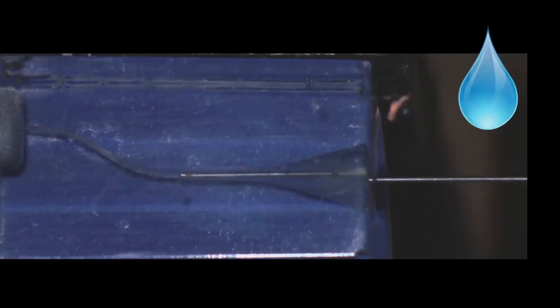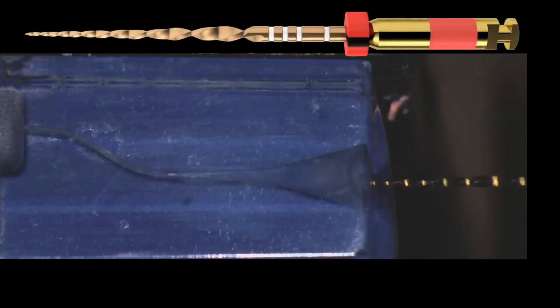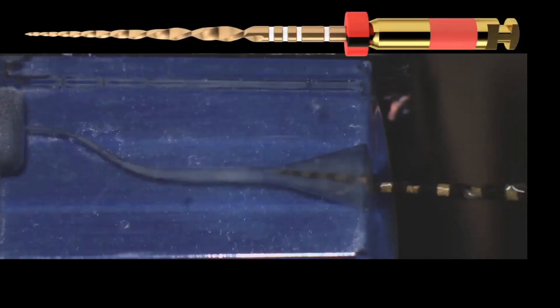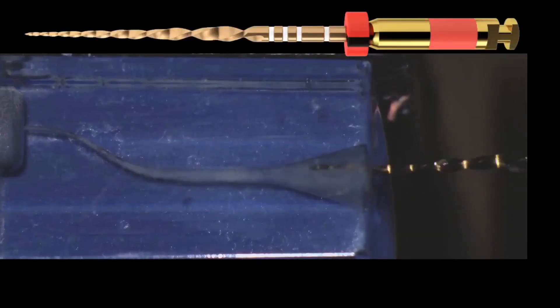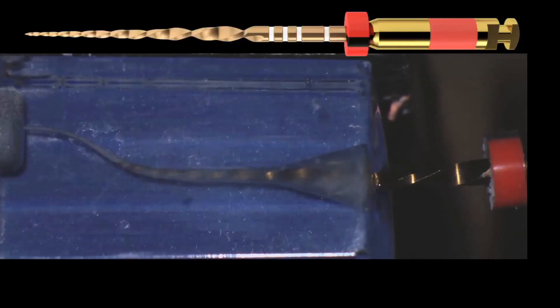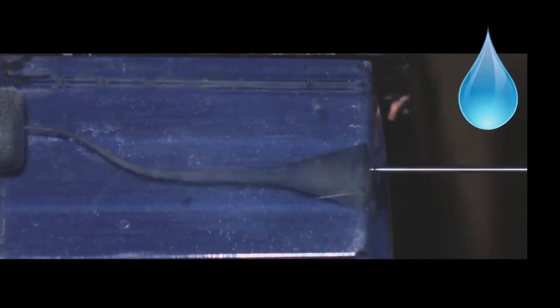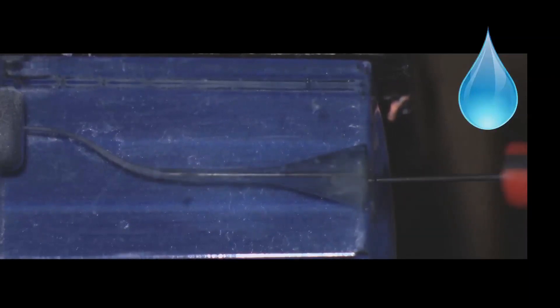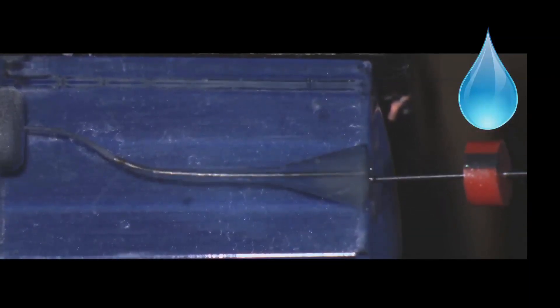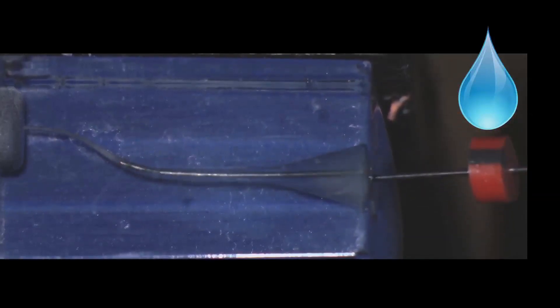Now we proceed to canal shaping with WaveOne Gold. In amplitude strokes of three millimeters, we initiate the instrumentation. You can see here clearly how effective and efficient this instrument is. The irrigation needle is now going to penetrate deeper and deeper into the canal — into just the space that has been created by WaveOne Gold. We remove the irrigation needle.